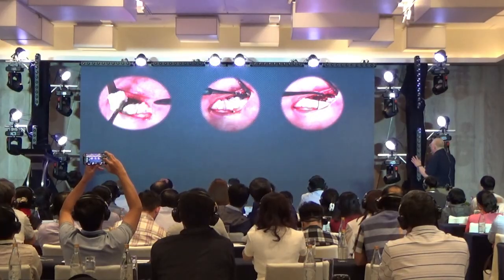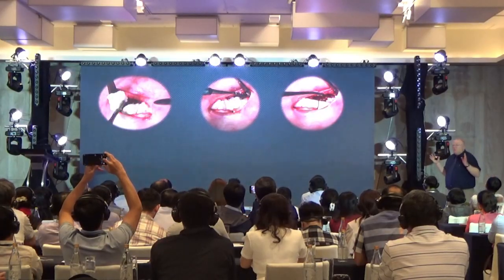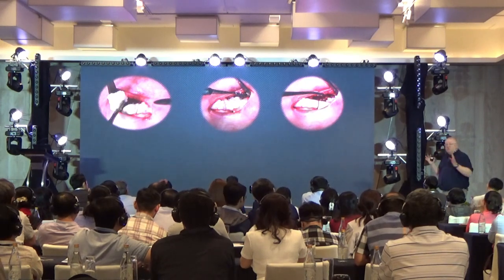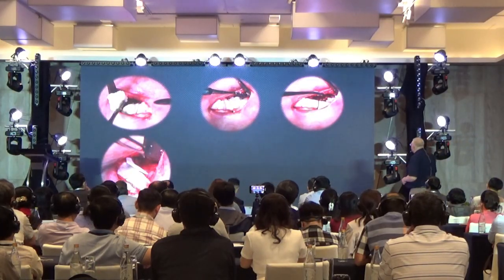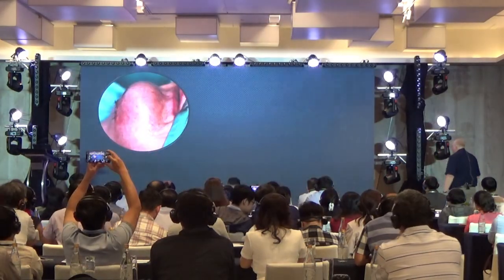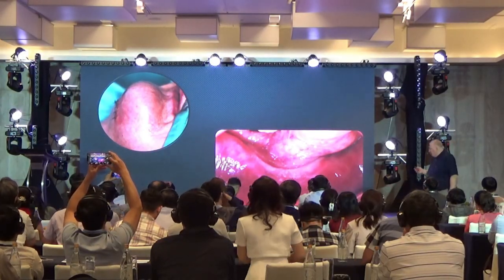We also did lateralization of the nerve because we wanted to gain more space, and by the submental approach to move the nerve is relatively not very difficult. And we covered it, and you can see nothing happened intraorally.